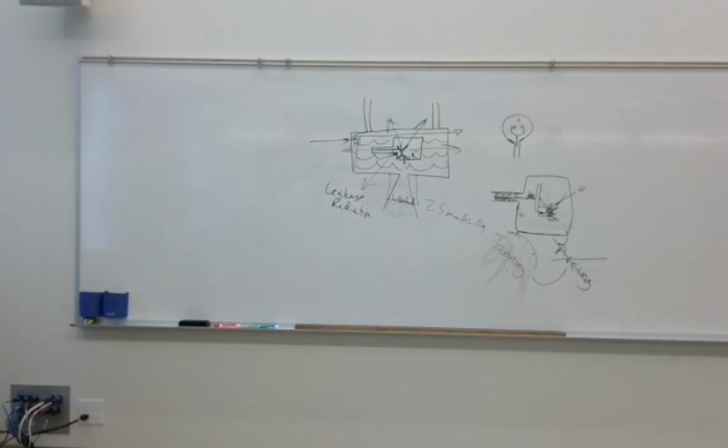Well, you're in prep stage. Where do they go once you hit exposure? Across the tube, right? So can you put more on it after that? Yeah. The answer is yes, but can you then have a high enough mA that you can't resupply enough electrons to bring it back up to maximum current? And the answer is yes. And so if you flip the page, that's what you refer to as saturation current.